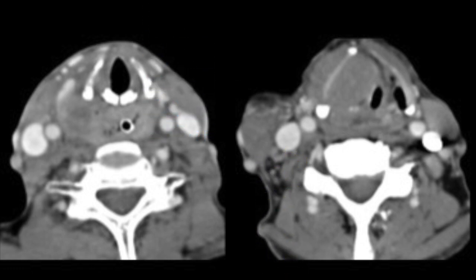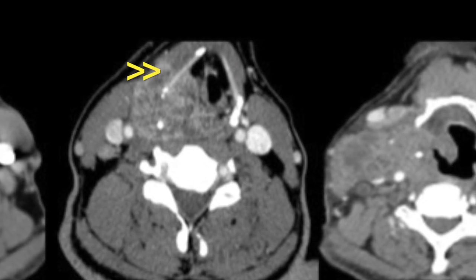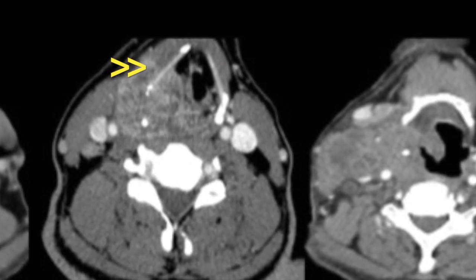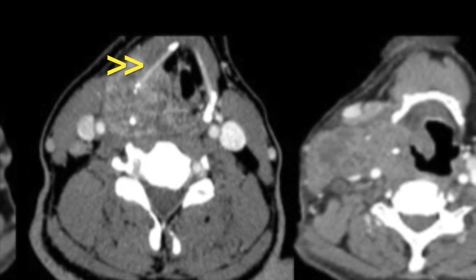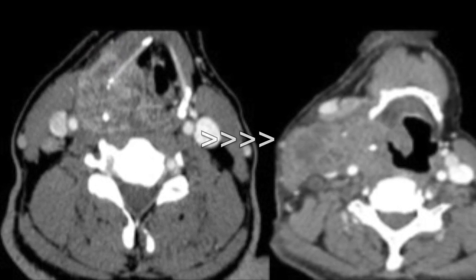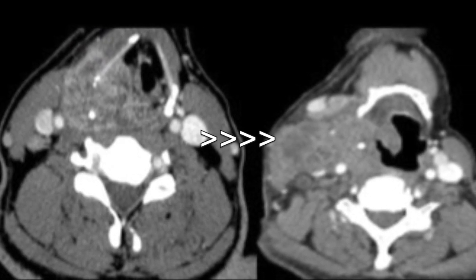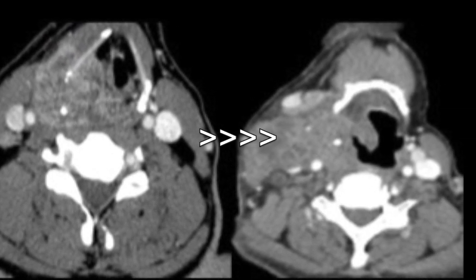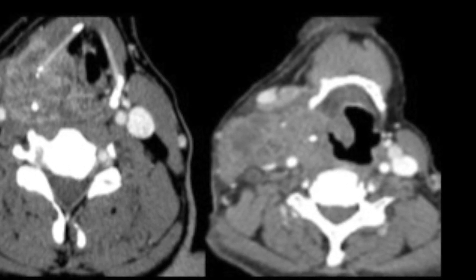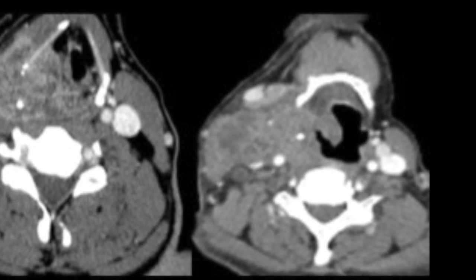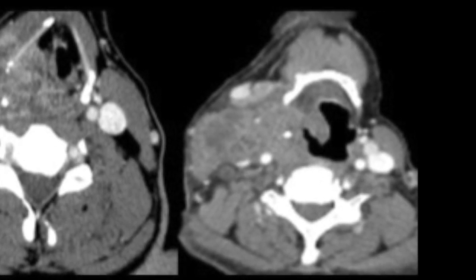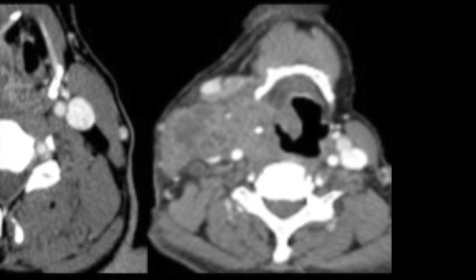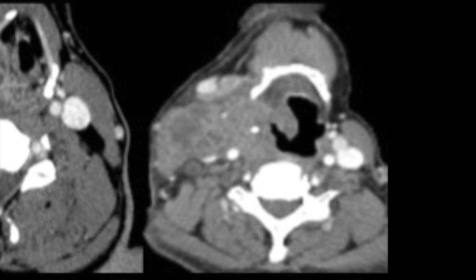In the next figure, the invasion of the cartilage is extensive with extensive involvement of the visceral space. In the last figure, we can appreciate large-volume disease merging with the nodal mass, encasing the carotid artery and invading the prevertebral fascia — this is T4B disease.